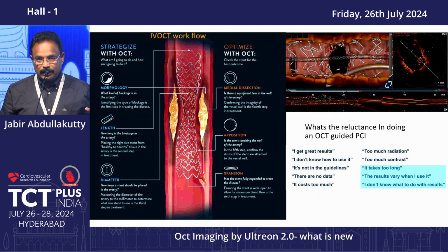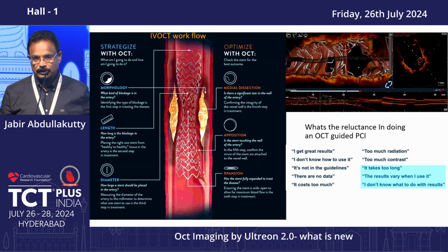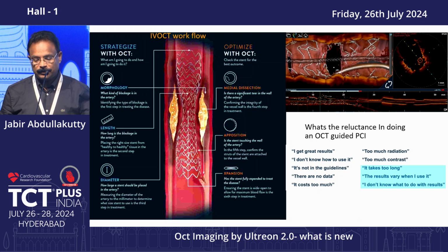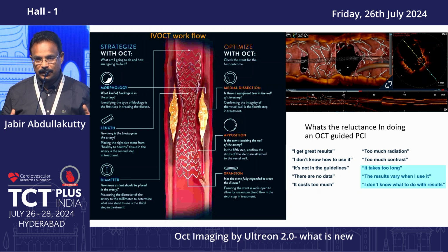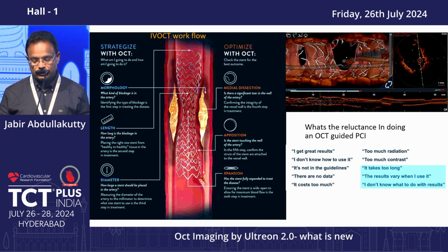So currently, worldwide, OCT has a workflow which is the MLD Max. We have great experience in OCT. The benefits of OCT everybody knows, but the take-up of imaging-guided PCI is much less across the world. There is some reluctance, or physician inertia. Basically, in a lab, it takes too long a time. So lab time is a problem. In a busy lab, the operator may find it too long, so I may avoid it. I have great experience with angiography-guided PCI, so I'll go without imaging.